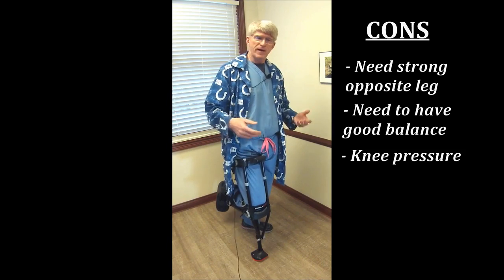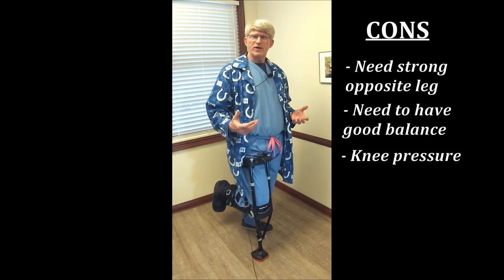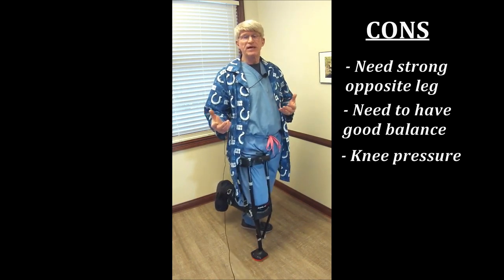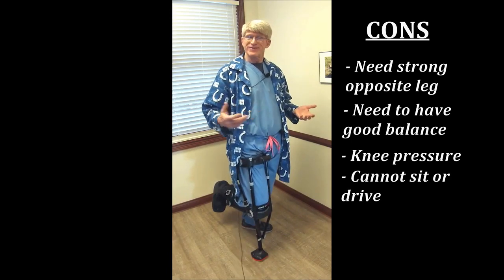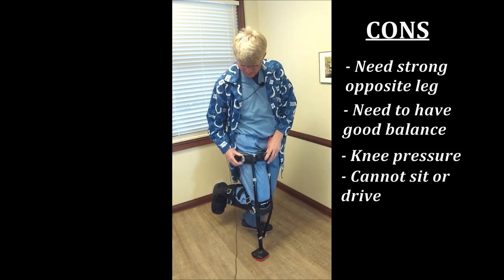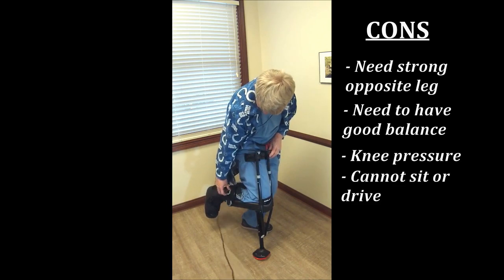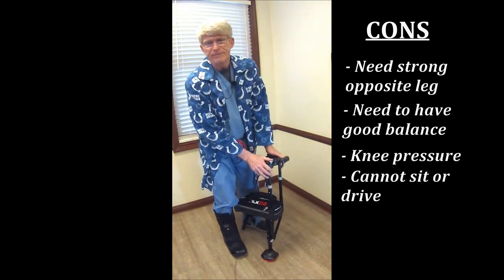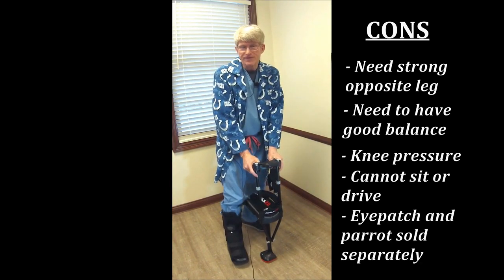Knee pressure is a problem. I have a little bump right below my knee, and after about 30 to 40 minutes of walking on this, it gets a little bit tender. If you have a similar issue, this may be a problem for you too. You can't sit or drive with this, but that's not really a big deal because in about 10 or 15 seconds you can remove it — if you've ever had a bicycle helmet or a backpack, you know how to do that. One of the other drawbacks is they don't supply you with an eye patch or a parrot.